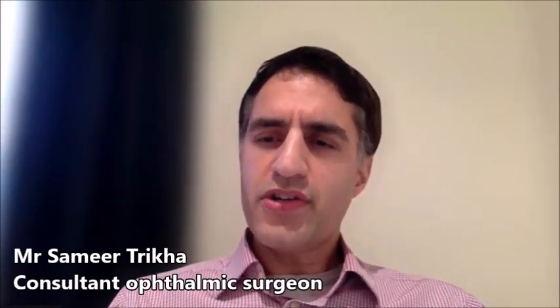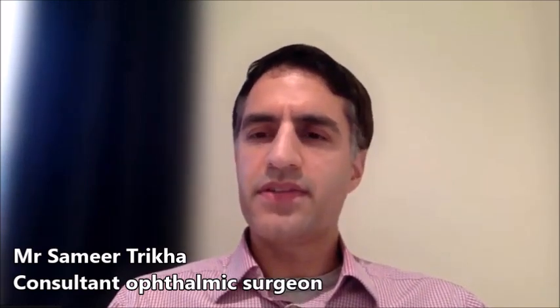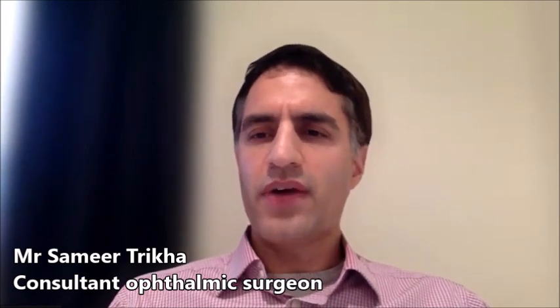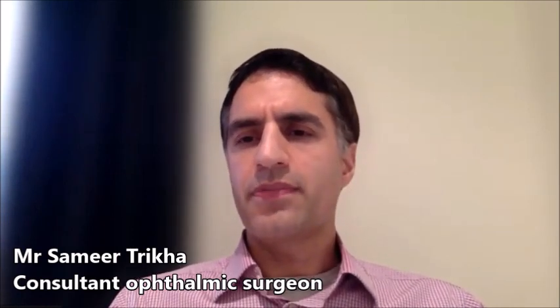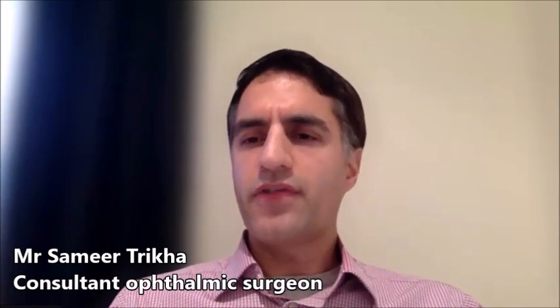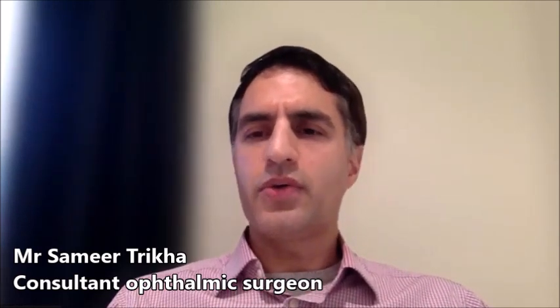In contrast to the first group, however, there are some small risks associated with this lens, which can include the development of certain visual phenomena, such as glare or some halos around lights, although generally this is fairly low, with about 5 to 10% of patients developing these problems. The good news is, in most cases, these effects wear off after a period of 6 to 9 months or so.